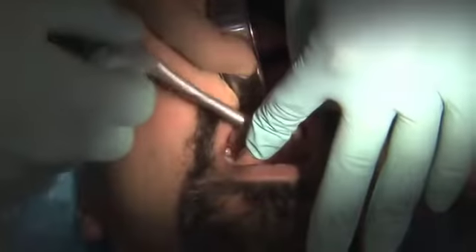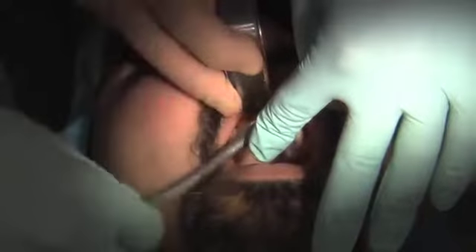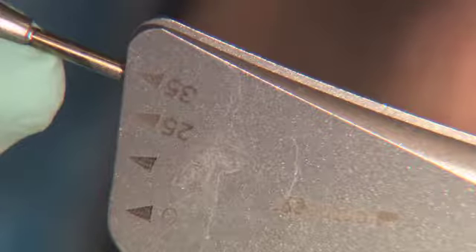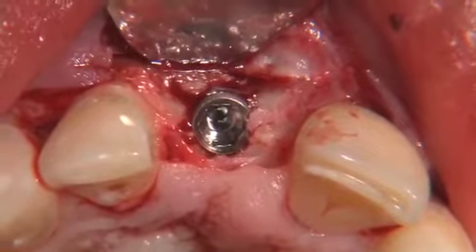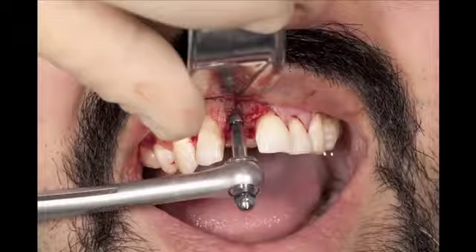Then the final placement of the implant is achieved utilizing the torque wrench, which will allow us to confirm our 35 Newton centimeters of initial stability that we're seeking. As there is a small amount of defect on the buccal there, the decision was made to augment the grafting in that area prior to suturing.